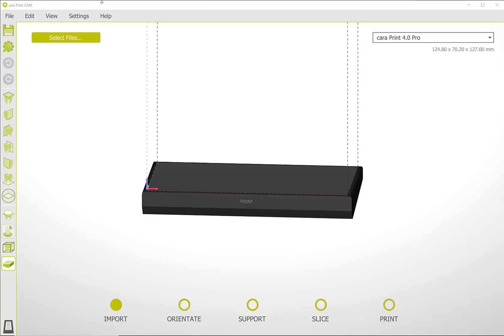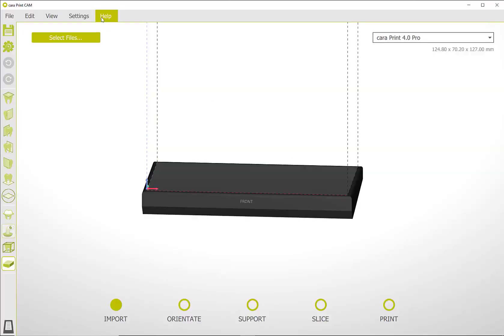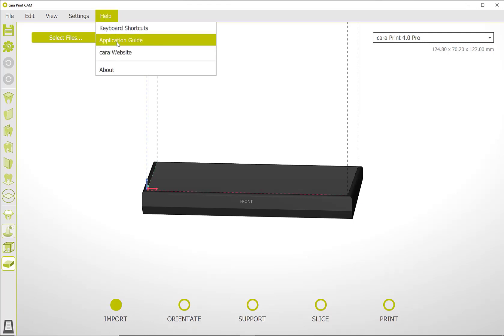Under the Help tab, you can view your software version. You will also find a direct link to the Cara website in your selected language as well as the current application guide and a list of available shortcuts.